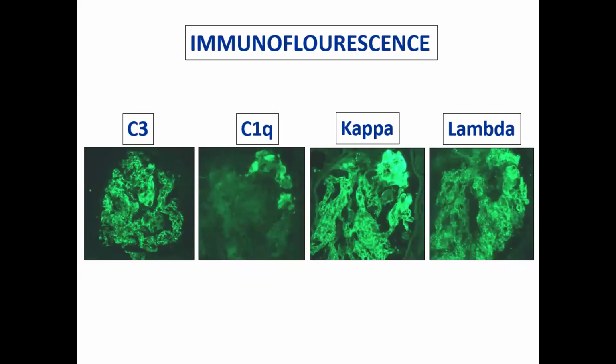What I was quickly trying to say is that one of the differential diagnoses, certainly in histopathology or histology also, is IRGN. Clinically also they considered the possibility of IRGN. The reason we came to this conclusion is the site of deposition. Usually in IRGN, you get the deposit in the subepithelial region. Here we had massive subendothelial and mesangial deposits in addition to subepithelial, which is quite unusual in IRGN.